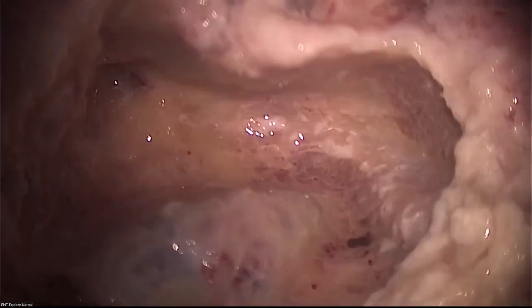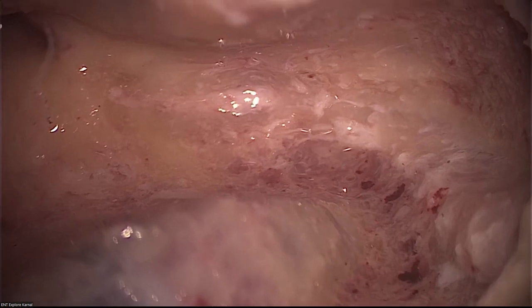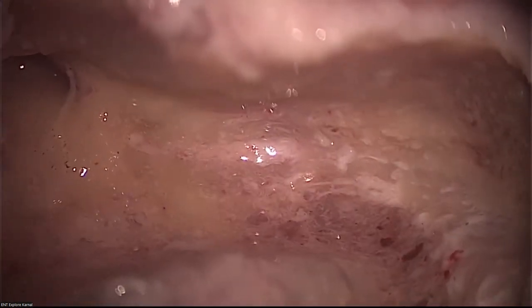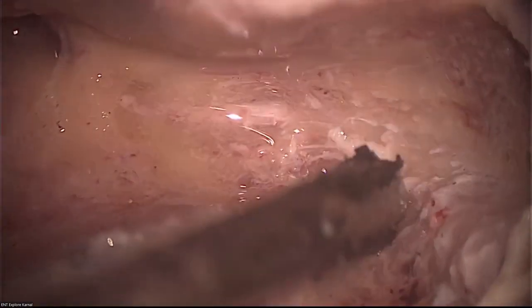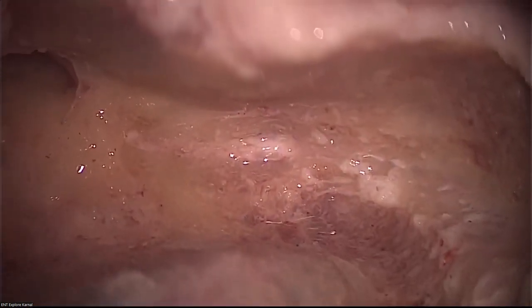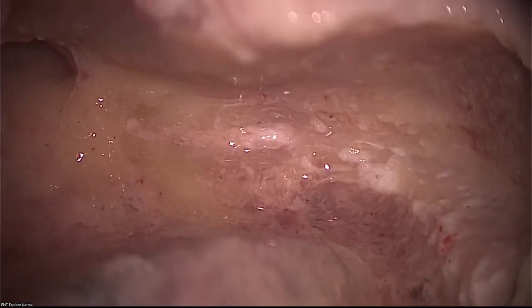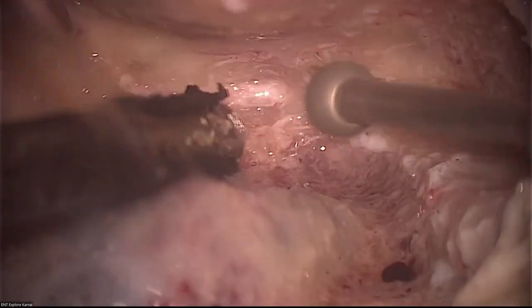Is the picture okay? It is a very narrow facial recess, it doesn't look normal? Maybe. But all these dimensions in the temporal bone, middle ear and facial recess are the same as they are at the time of birth. Only the curvature of the external auditory canal may change, but the dimensions of the middle ear structures, this facial recess, they remain the same.